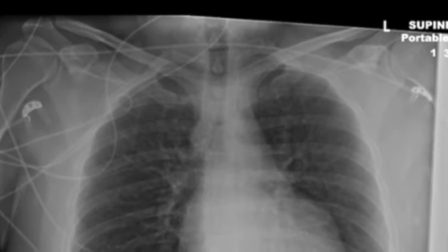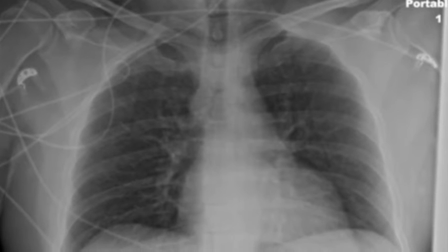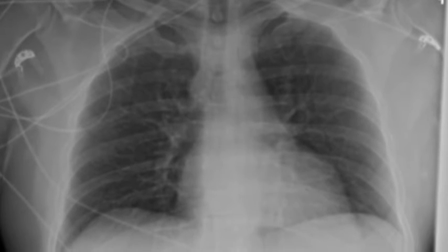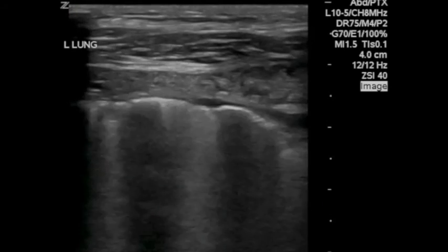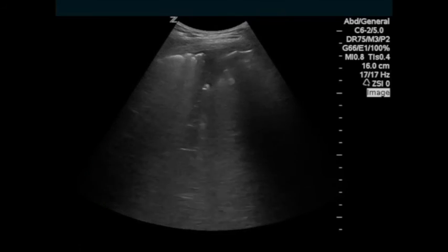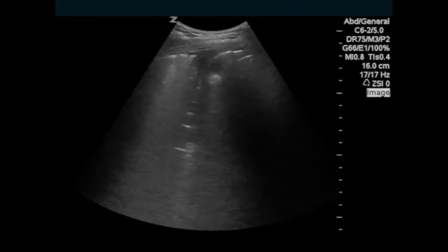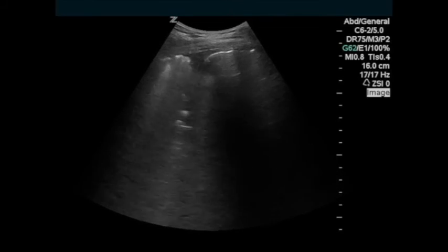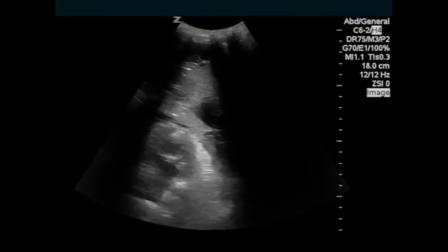Finally, ultrasound can also be used to evaluate for pneumonia with a sensitivity around 96%, much better than that of supine chest X-ray. The appearance of pneumonia can vary depending on its stage. Early in the disease process, often the first ultrasound finding is a pleural line that becomes thick and bumpy. Next, as the lung becomes filled with fluid, B lines will appear. The B lines will be confined to the area of pneumonia, unlike the diffuse B lines seen in CHF. Finally, as the lung becomes consolidated, the lung tissue takes on an appearance similar to that of liver or spleen tissue. Ultrasound is a valuable tool in evaluating the patient with undifferentiated dyspnea.